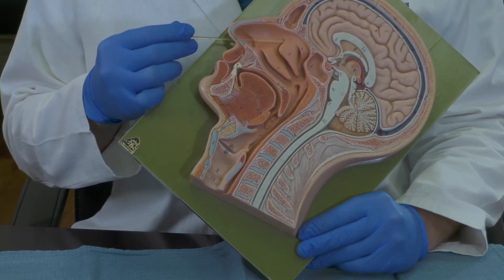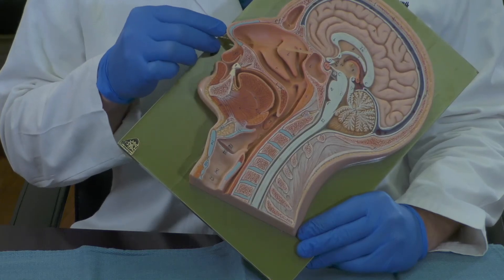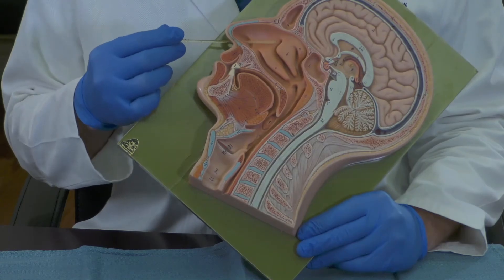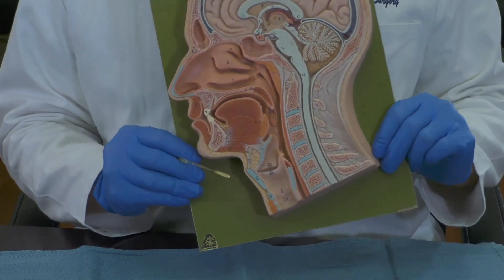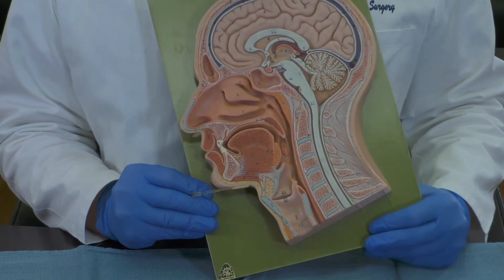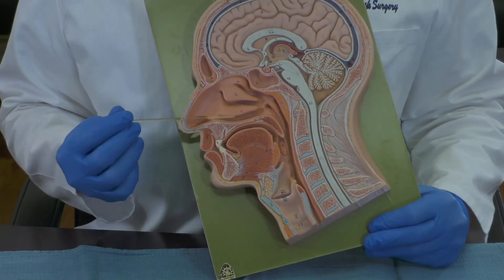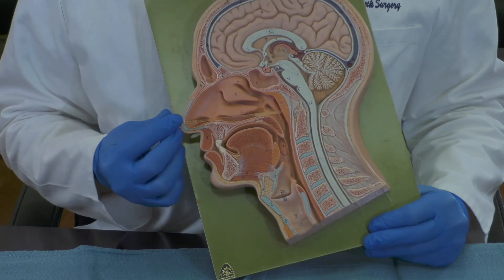Or if you're slipping past the middle turbinate, you could end up into the skull base or into the sphenoid sinus. Both would be very uncomfortable and injurious to the patient. What we would recommend is that you actually tilt the head forward very slightly, only about five degrees. This would allow you to insert the swab along the floor of the nose in a horizontal direction.